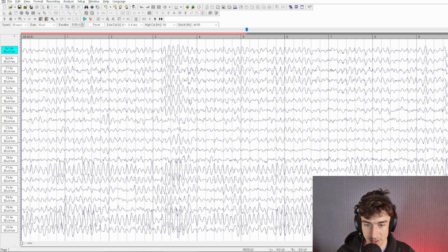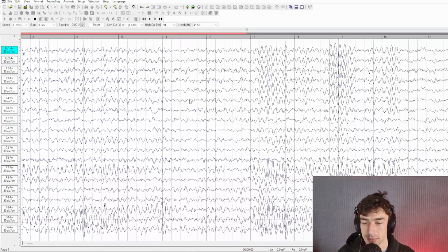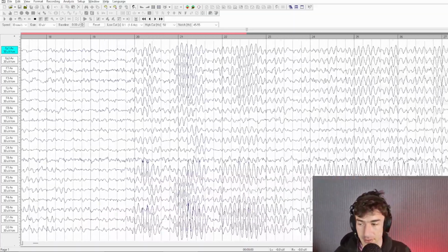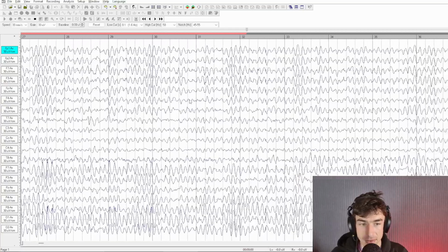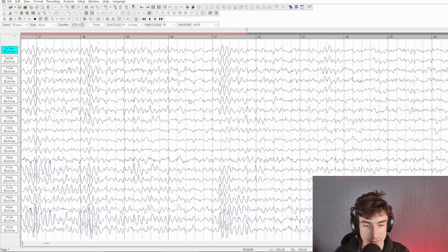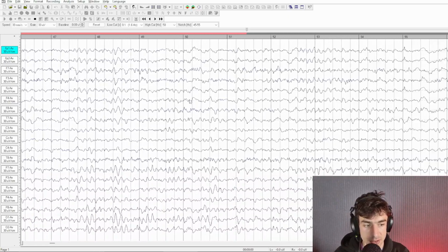And what do we see? Well, no surprise, a lot of drowsing. And we still see some of the EMG activity at T8. We're not scaled super high, but we are seeing just lots of alpha, and it's coming and going, coming in fits and starts.